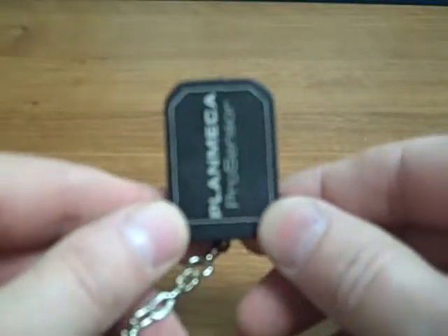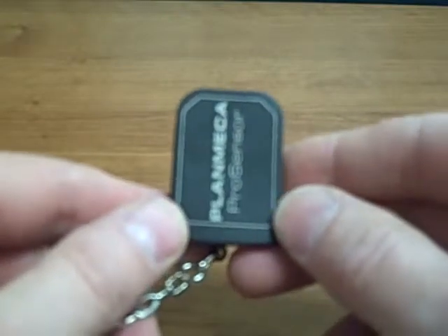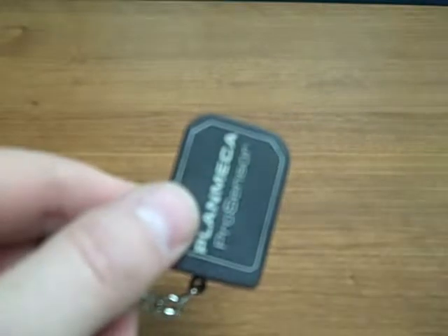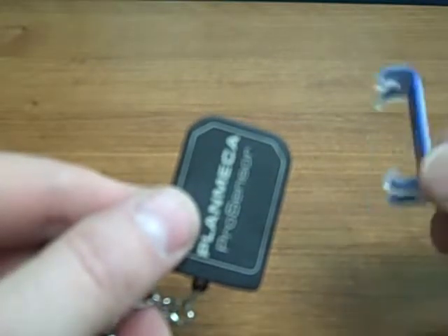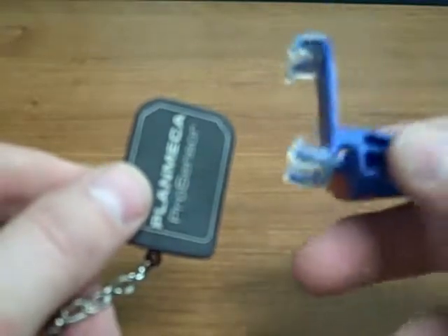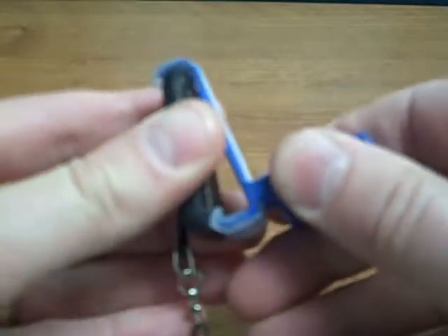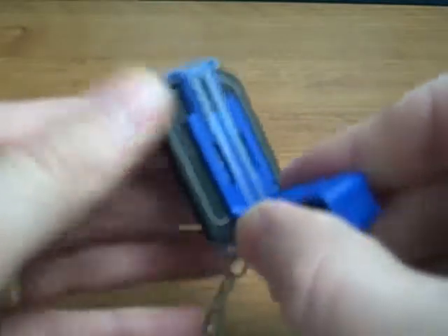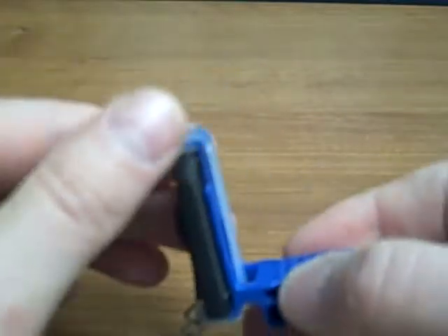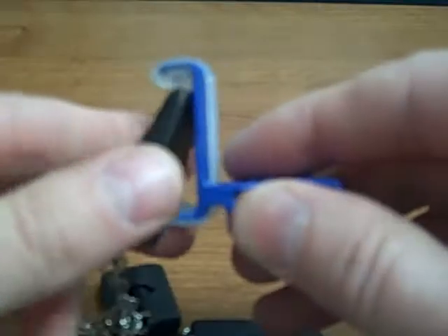This is a demonstration of the RIN XEPDS Fit Universal Sensor Holder System with the PlanMECA Pro Sensor. Here I'm holding a size 2, and one of the neat things about the XEPDS Fit System is that one bite block will work with a size 2 or a size 1 sensor. The adjustable clip just stretches out to allow for the different size sensor — here you can see it accommodating a size 2, and it will also accommodate a size 1 sensor.